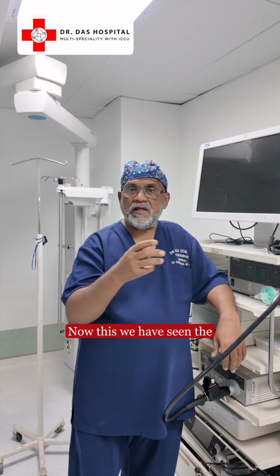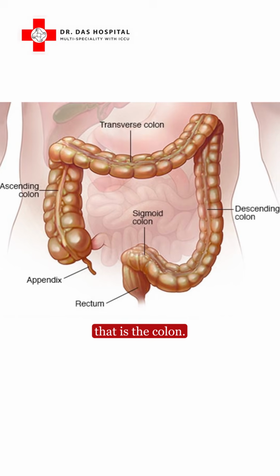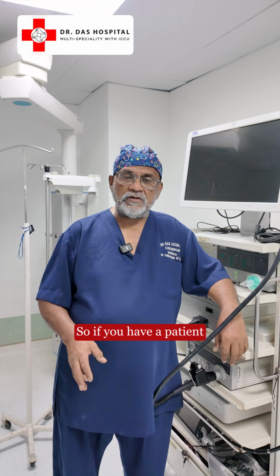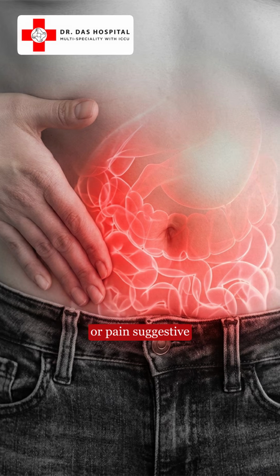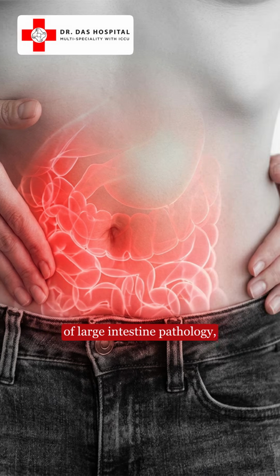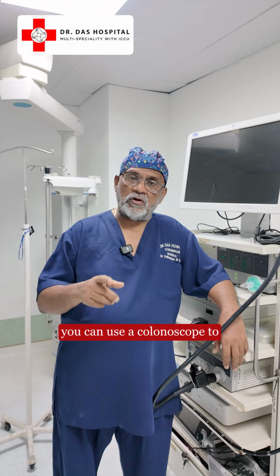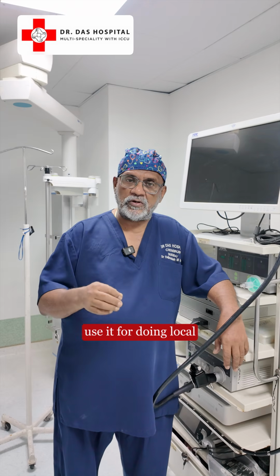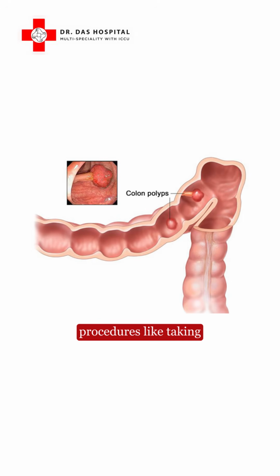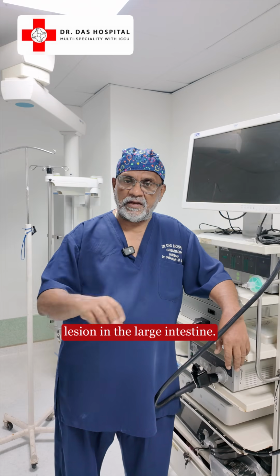Now, we have seen the upper end of the alimentary tract. For seeing the lower end of the alimentary tract, that is the colon, if you have a patient who has bleeding per rectum or mucus per rectum or pain suggestive of large intestine pathology, diverticulitis or even CA of the colon, you can use a colonoscope to examine, take a biopsy, and at times you can also use it for doing local procedures like taking out a polyp in the large intestine or any other lesion in the large intestine.